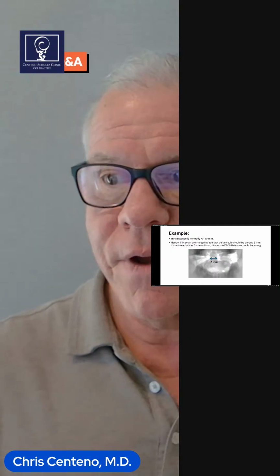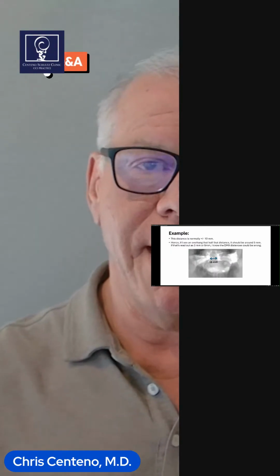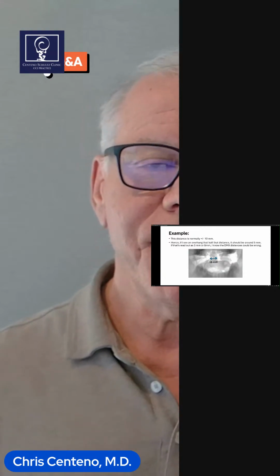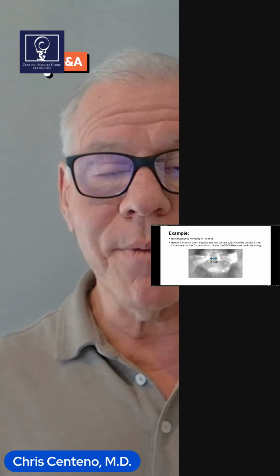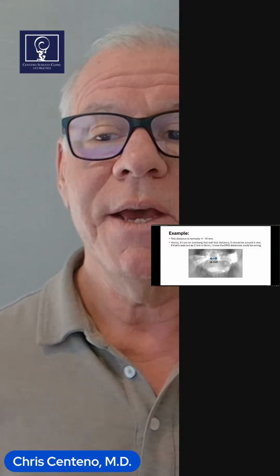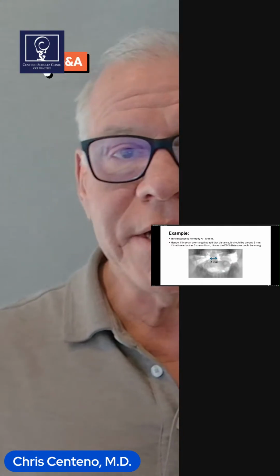And so I will not frequently, but again, about 1 in 5 times, overrule the measurements I'm seeing in the report because they don't make sense with the anatomy. Now that's a big problem, right? When I get a report, I expect those distances to be spot on, but they weren't always spot on.